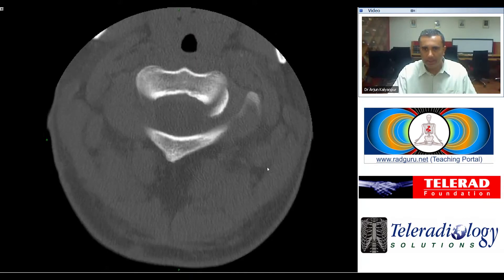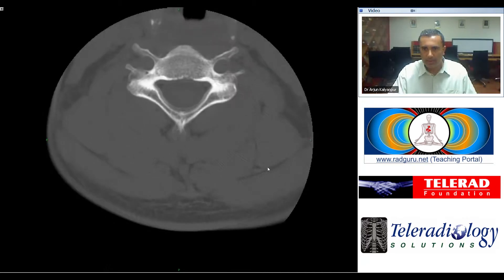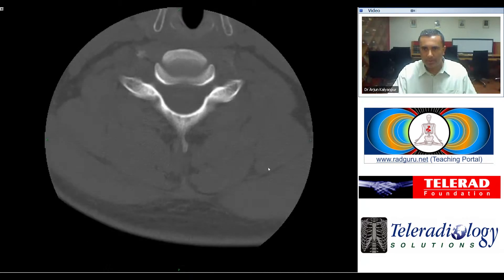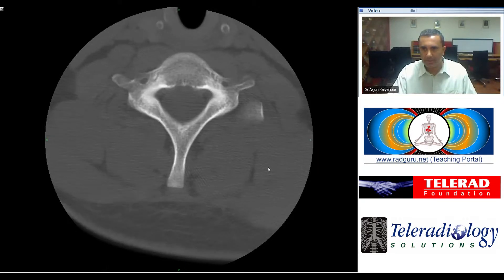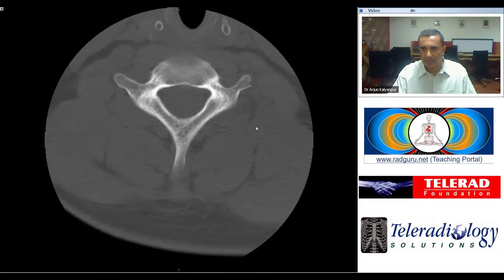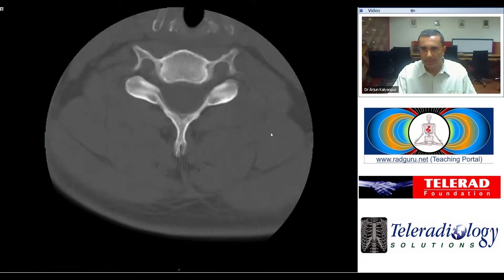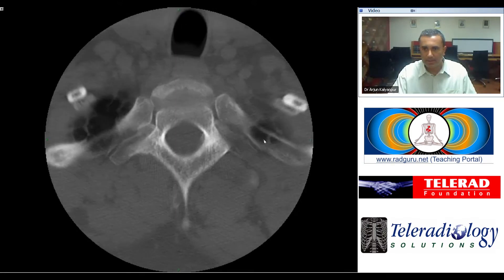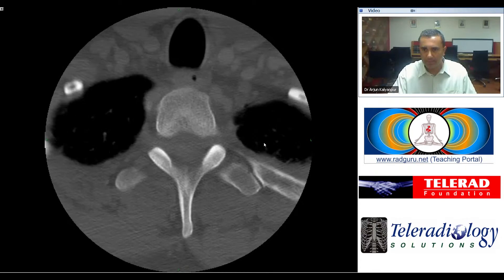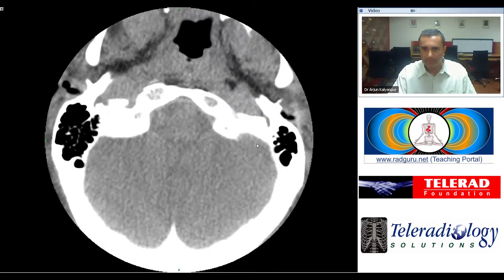As we scroll up and down, back and forth, the only hint or suggestion of abnormality is in this left transverse process, where it looks like there may be a faint lucency. But this is quite difficult to pick up prospectively on axial images because of volume averaging effects.